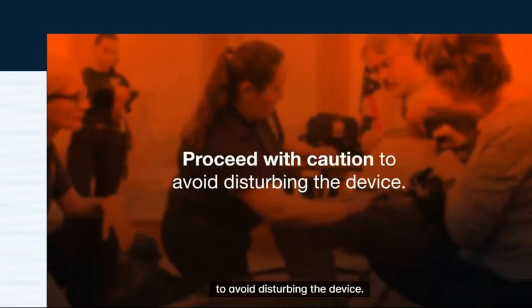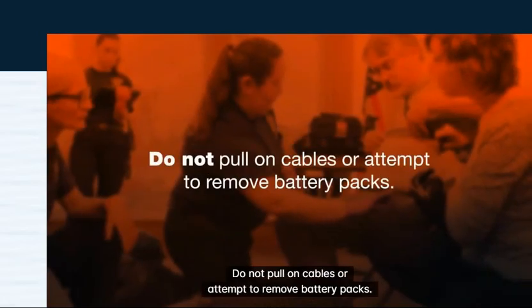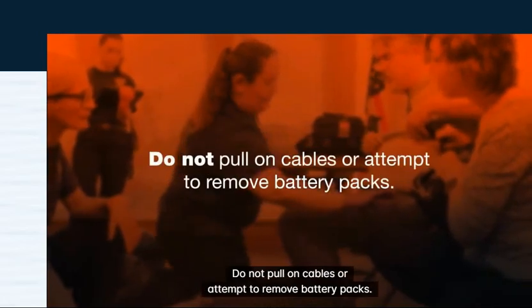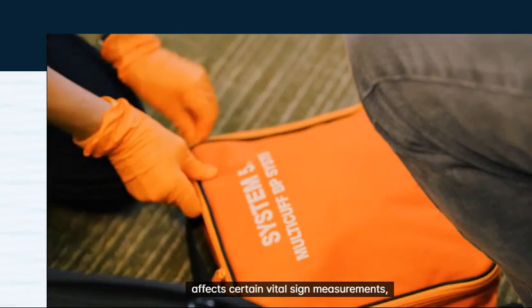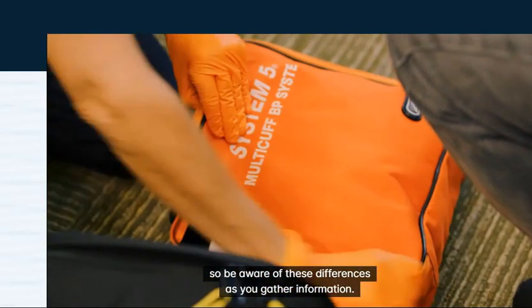Proceed with caution to avoid disturbing the device. Do not pull on cables or attempt to remove battery packs. Keep all device components within reach of the patient. The presence of a VAD affects certain vital sign measurements, so be aware of these differences as you gather information.